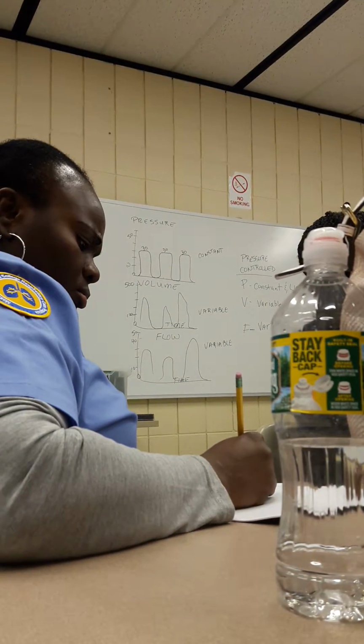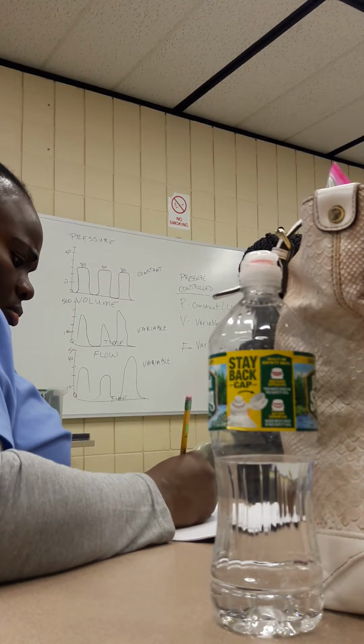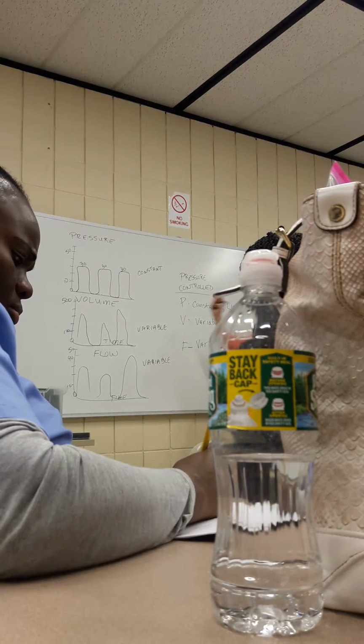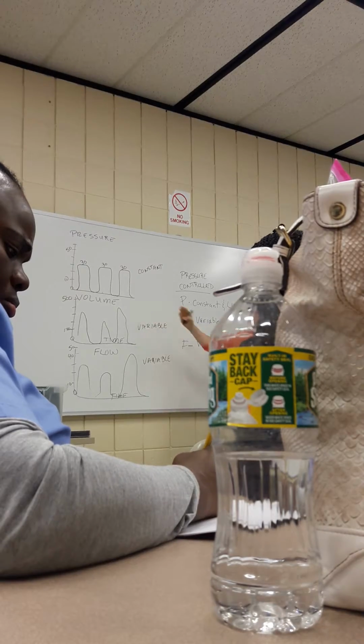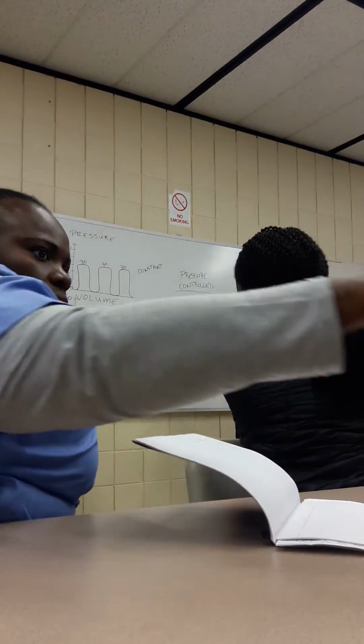The pressure is limited. Volume is variable. Flow is variable. Okay? Alright.